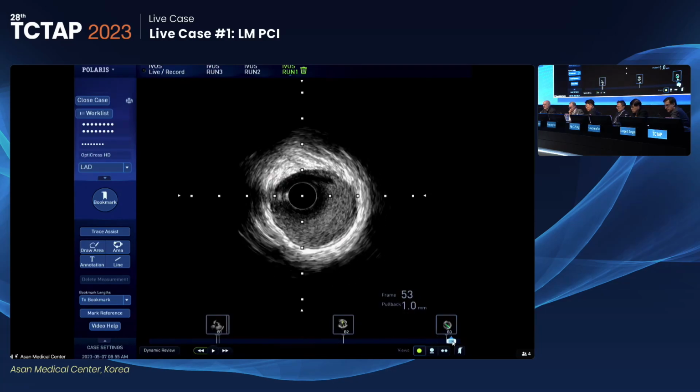Okay, you see at 12 o'clock, you see that black thing? That's probably some intima lifted up by the wire, maybe with a little bit of thrombus. Not that it's going to impact anything, but you sometimes see this when there's a wire crossing. Wow. But there's a clear small dissection from 12 o'clock to around 2 o'clock. Yep. Very interesting. Go ahead.